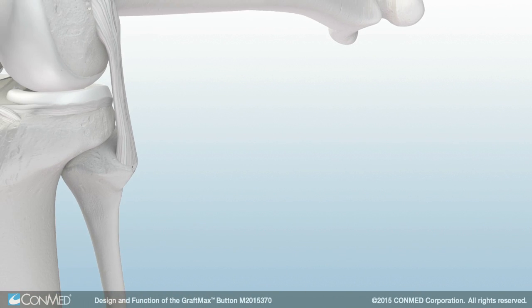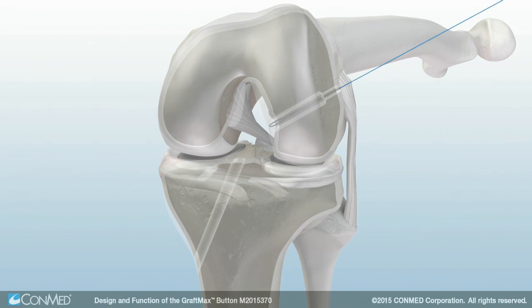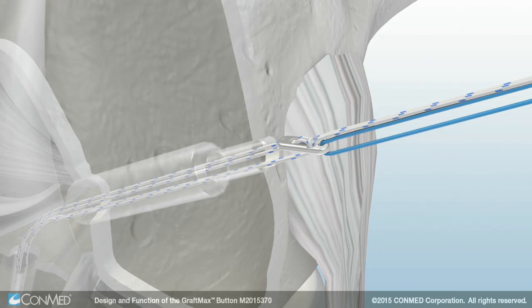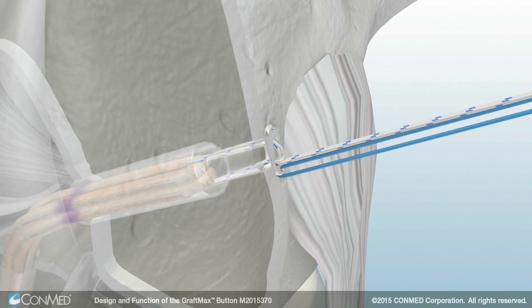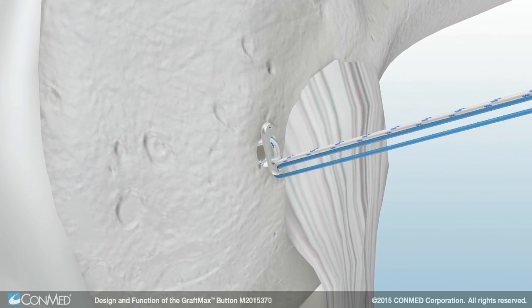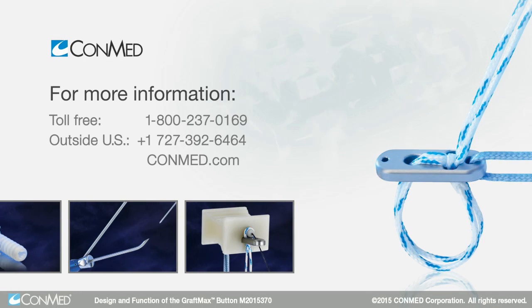The GraftMax button is advanced into position by pulling the two solid blue lead suture strands while taking care to keep slack out of the striped adjustable loop sutures. Once the button passes through the cortex, place tension on the graft to deploy the GraftMax button. Hold both striped adjustable loop sutures to advance the graft into the socket, then place tension on the graft to lock the button's dual lock mechanism.